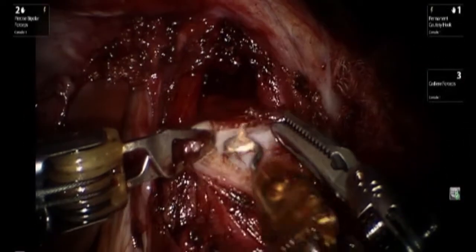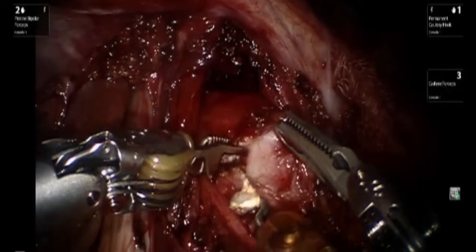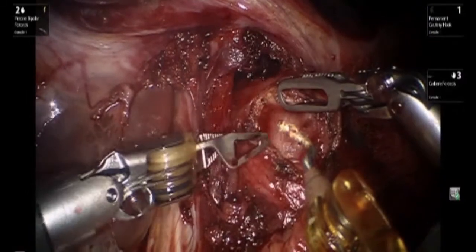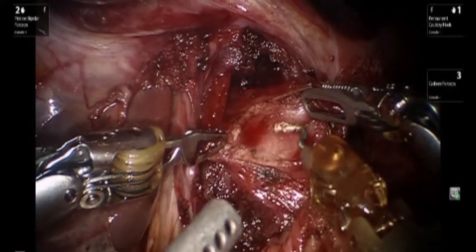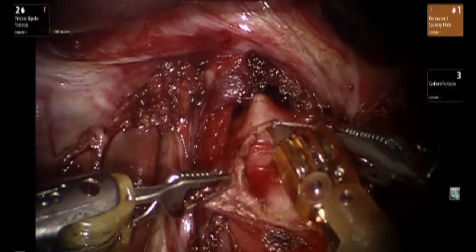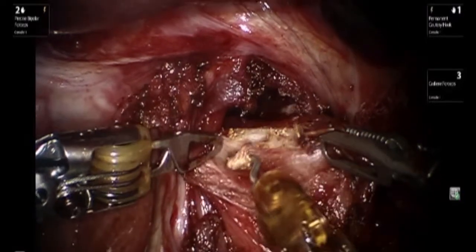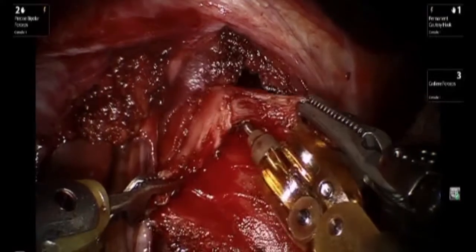Once a plane is created between the circular muscle layer and the underlying mucosa, one can then utilize the robotic instrumentation almost like a finger to gently dissect and create a plane. This dissection will continue along the esophagus into the posterior mediastinum in order to get at least 6 cm of myotomy along the esophagus.